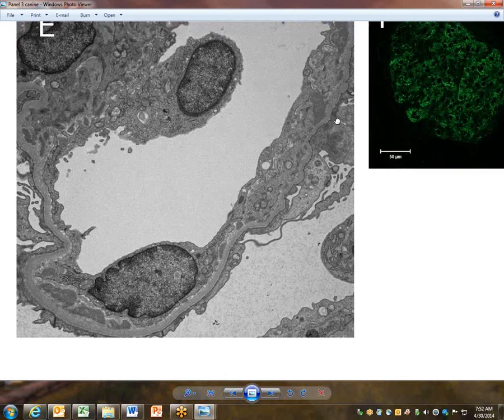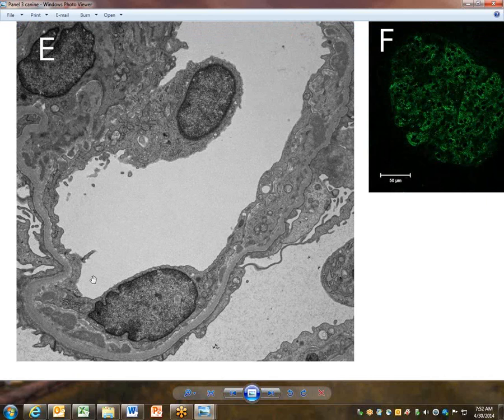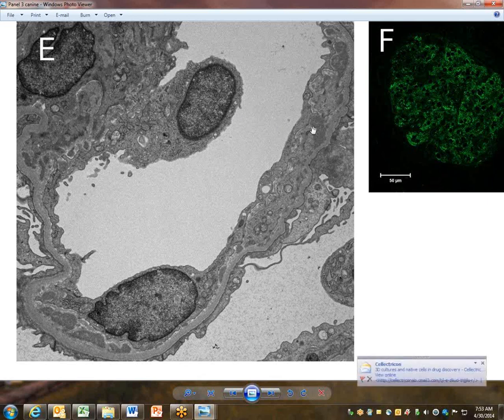Now, they're all in the place where they need to be. Rachel made the point before: when the immune deposits are on this side, the immune amplification system turns on all the complement and recruitment of inflammatory cells and cytokines that make such an endocapillary cellular reactivity. All that's happening because these are on a side where the bloodstream is bringing all those materials for inflammation to it.